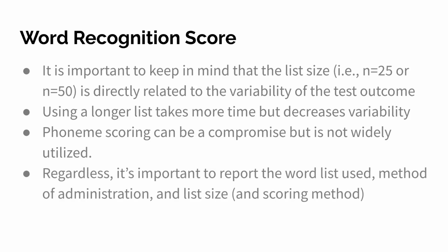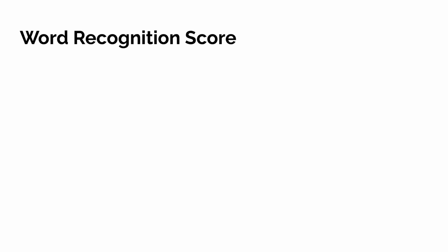Regardless, it's important to report the word list used, the method of administration, the list size, and ideally the scoring method, that's not commonly reported. Occasionally, I've used phoneme scoring, and I'll report phoneme scoring if I do. If they don't report the scoring method, it can be assumed that they're using whole word scoring.